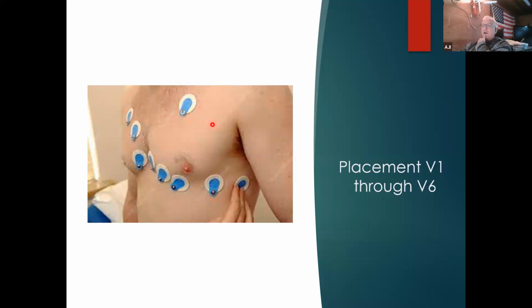So when we see on the monitor, when we run this, we are going to be able to visualize what is happening in that particular angle of a heart. And we could identify an active ST elevation MI by doing that. And an ST elevation is what they'll see on the EKG in a certain portion of the rhythm strip.